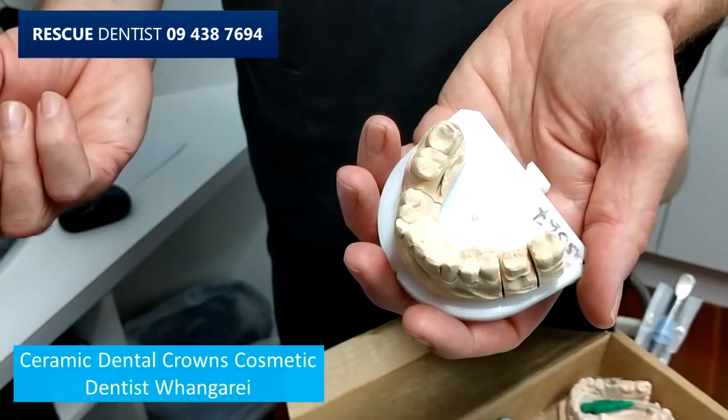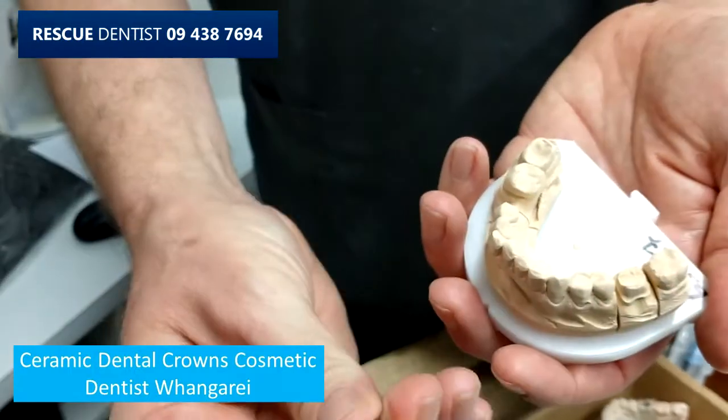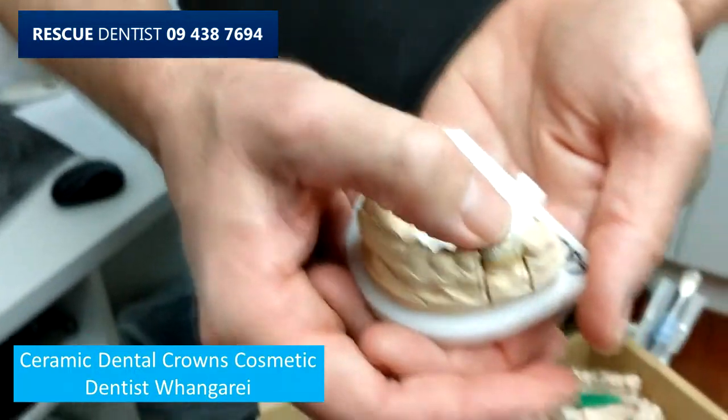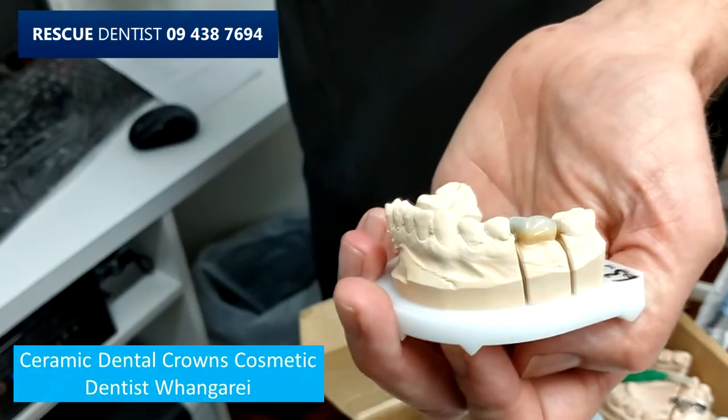That's one crown, and that's another ceramic tooth which, when it's glued over, restores the tooth. As you can see, this is quite an old patient — it's quite a grey tooth.